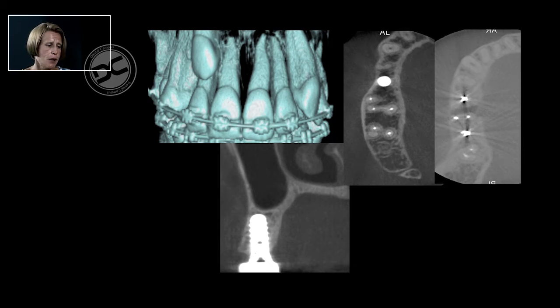Here you see, for example, a machine that has a reconstruction algorithm that is quite robust against metal artifact, but at the same time, this wire that is used with the brackets also doesn't have a high metallic density, as such not giving too much scatter.